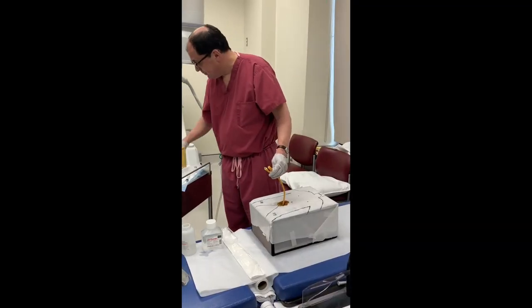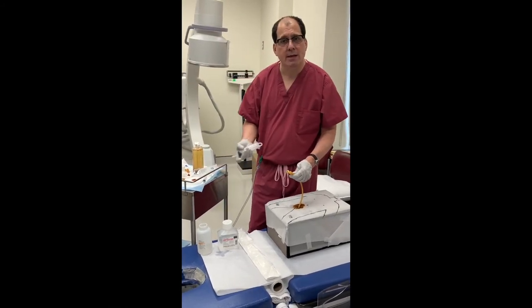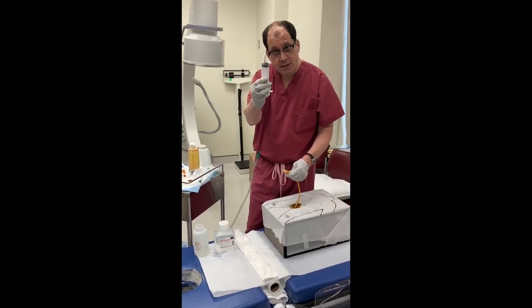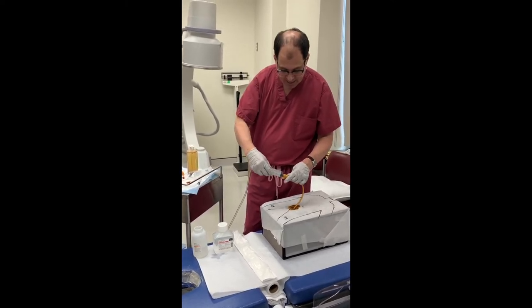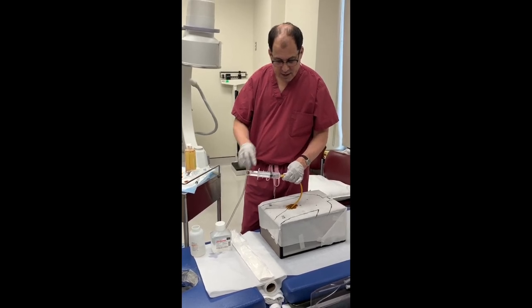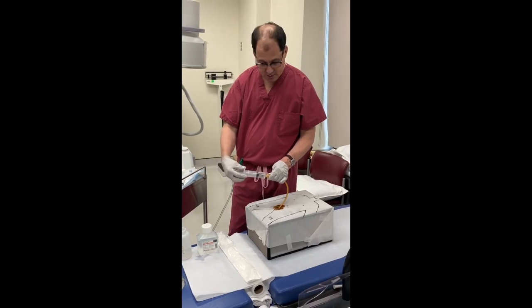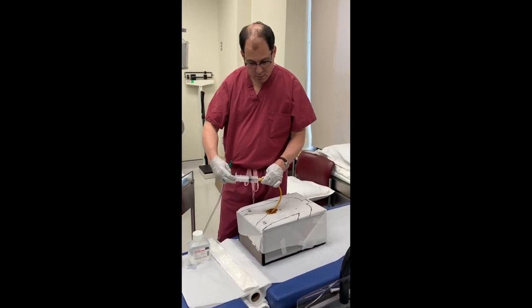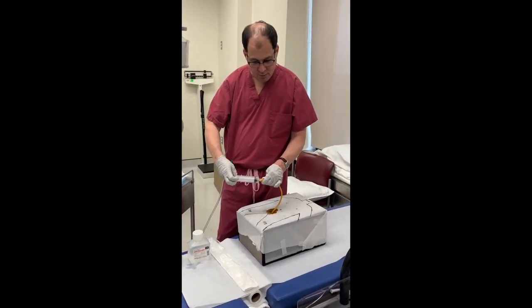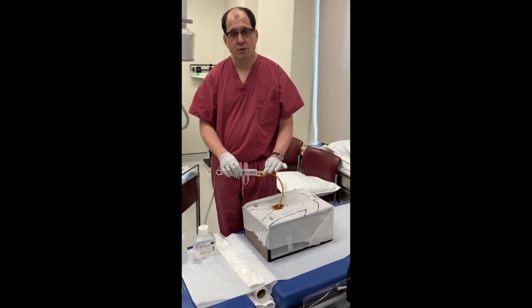Next, if you're still not sure whether the suprapubic tube is in, take your empty syringe, connect it, and pull back. You see that? This means it's properly placed in the bladder. The water goes in, water goes out — that's how you can confirm that you did a good job with the suprapubic tube.